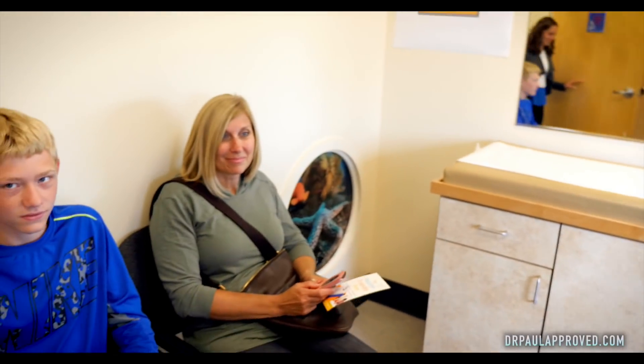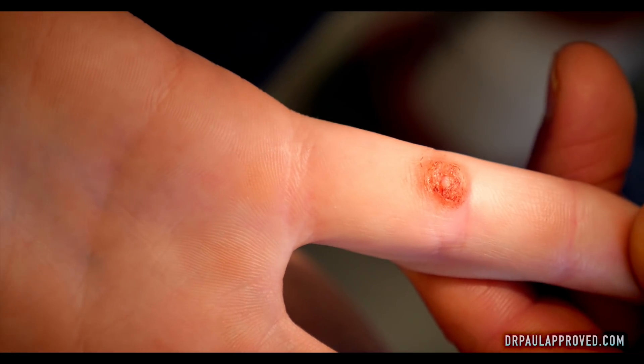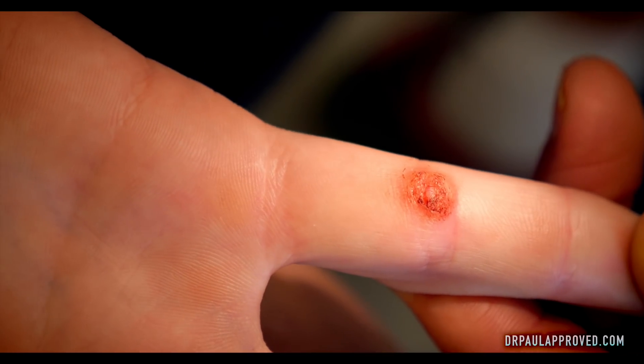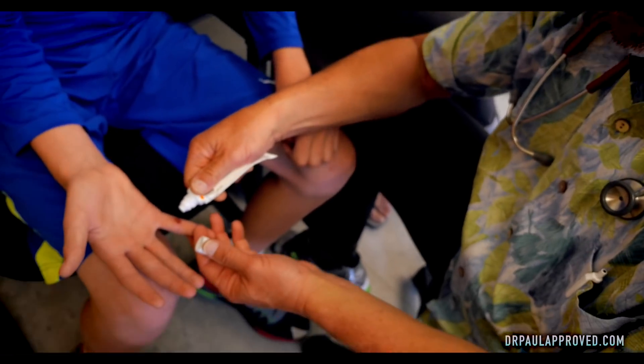So, I understand that you've got something on your finger I'm supposed to look at. You might have been picking at it. It's been frozen like four times at home? Yeah. Sometimes those home freezes just don't get a deep enough freeze.